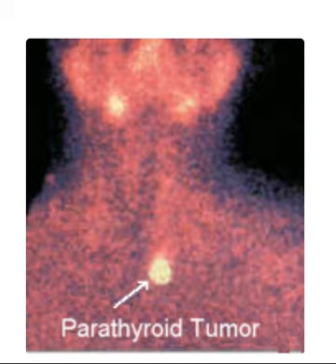Minimal prep work is required for an individual who plans to undergo a Sestamibi scan. Individuals can eat and drink as they normally would leading up to a Sestamibi scan. Additionally, patients won't have to remove any clothing or jewelry as part of a Sestamibi scan. For women who believe they may be dealing with HPT and are planning to undergo a Sestamibi scan, however, it is important to tell a doctor if you are pregnant or breastfeeding. Since a Sestamibi scan involves the use of a radioactive agent, this form of HPT testing may not be suitable for women who are pregnant or breastfeeding.